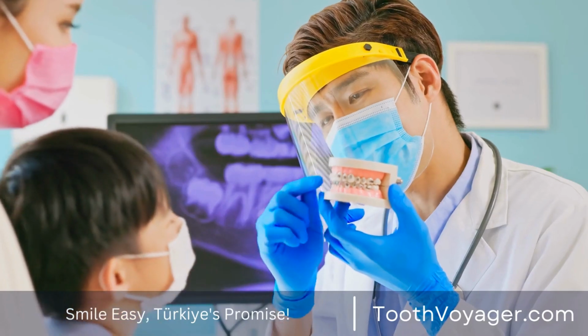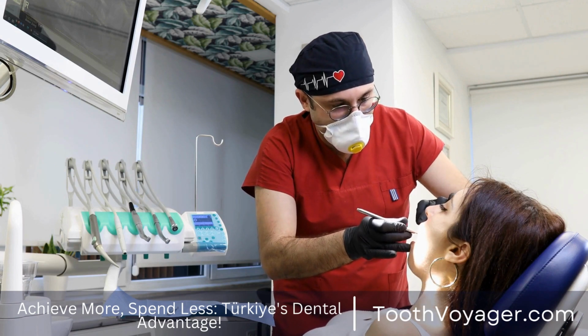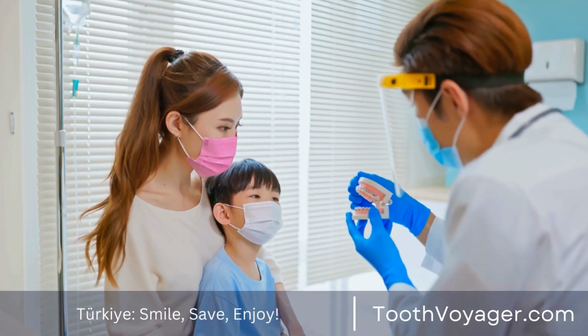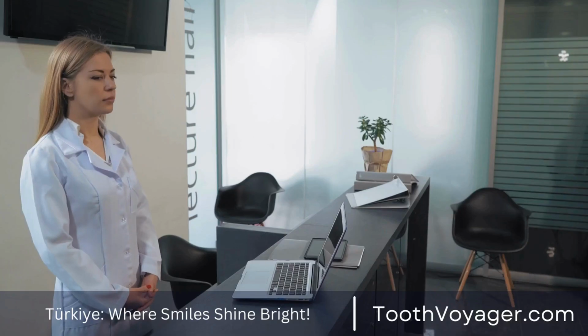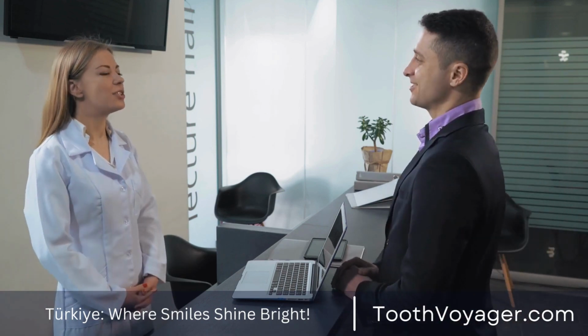Healing process. Once the implant is installed, it will require some time to heal before the final restoration is able to be attached. The healing process could take some time, since the implant must connect to the bone prior to it being able to support the final crown.